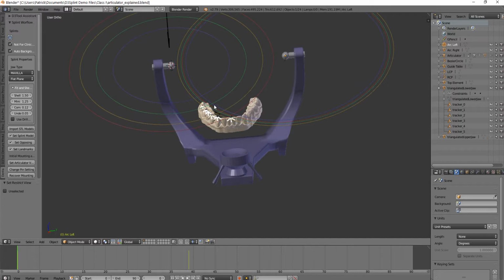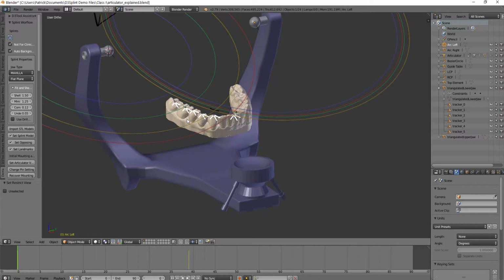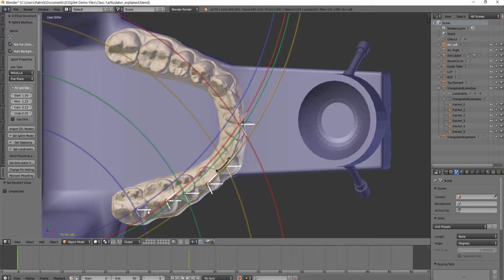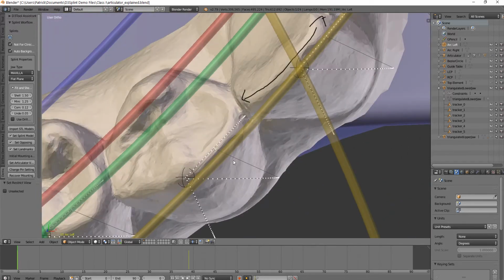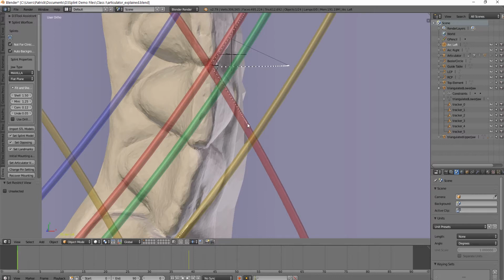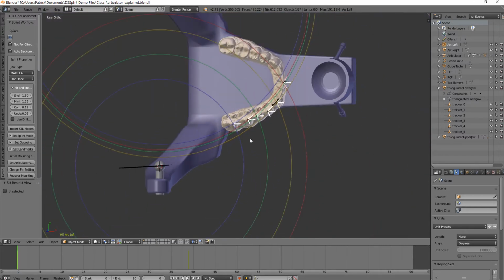So from that, I'm going to say that our articulator does match our expectations in terms of its behavior, and that in the extremes, towards the extreme of the movement, the simulation does break down just a little bit, and I believe that gets more significant the further away from the condyles we get. So you can see that up here we're almost out to the border of our little 1/2 millimeter guide, but more towards the posterior we're just slightly off the center. And I guess there are reasons for that.